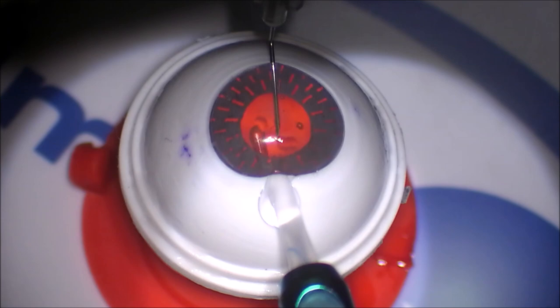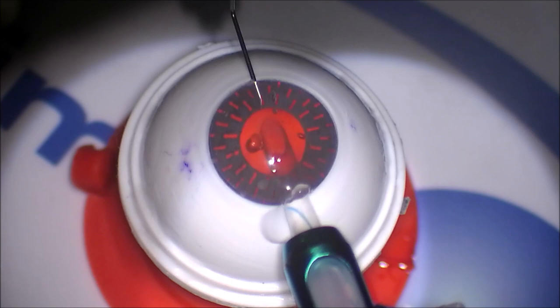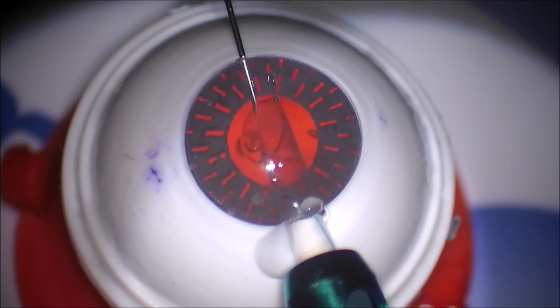So the injector goes in with the bevel down. The needle is through a limbal incision contra-incisionally. My technician is advancing the haptic, the leading haptic. As it comes out, you want the haptic to engage the bevel of the needle. The bevel is facing towards the right. You see I'm going to engage it, dock it.